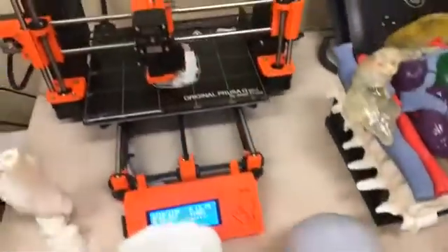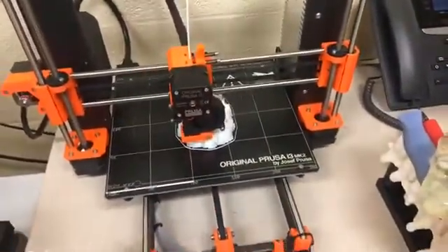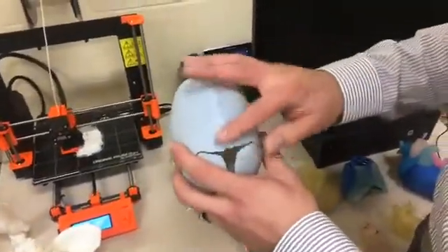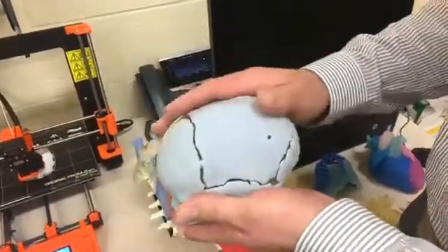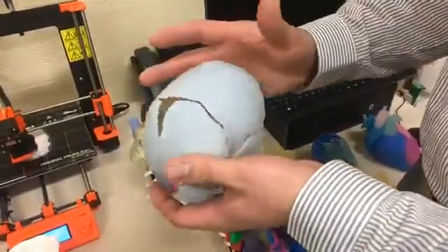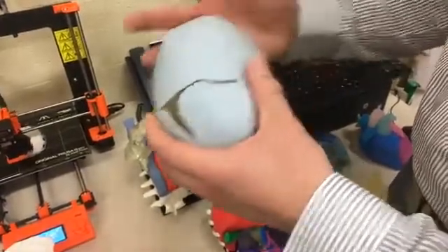So craniomaxillofacial is another specialty that reached out to us. In this skull, there's cranial synostosis. This center line should not be fused like it is. It should be separated. So our surgeons can use this to reshape the skull so that there's plenty of room for this infant's head to grow.